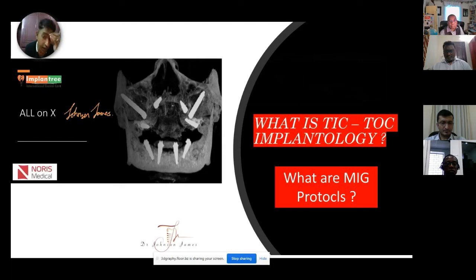3D planning team to deliver predictable implant options, right from single implants to advanced implants such as pterygoid and zygomatic, into a correct anatomic guided position, so that you don't falter, and we are able to get bicortical anchorage in these kinds of cases, which adds to long-term stability, patient success, and better ROI for our dentists. So this is one protocol, but I'm not going to talk about it today, because it is a lecture by itself. Here you can see the case we're going to discuss today.